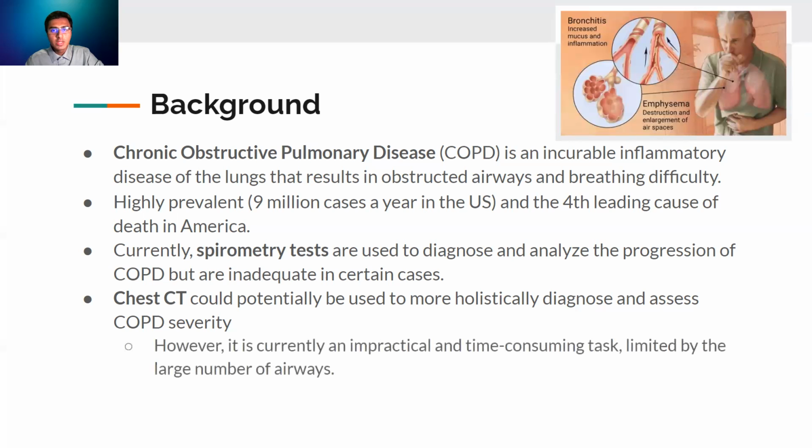However, it is currently an impractical and time-consuming task, limited by the large number of airways that have to be manually assessed. In addition, different radiologists might produce different interpretations of the scan based on visual inspection, making it difficult to reproduce the results of manual analysis. This is where our project comes into play.